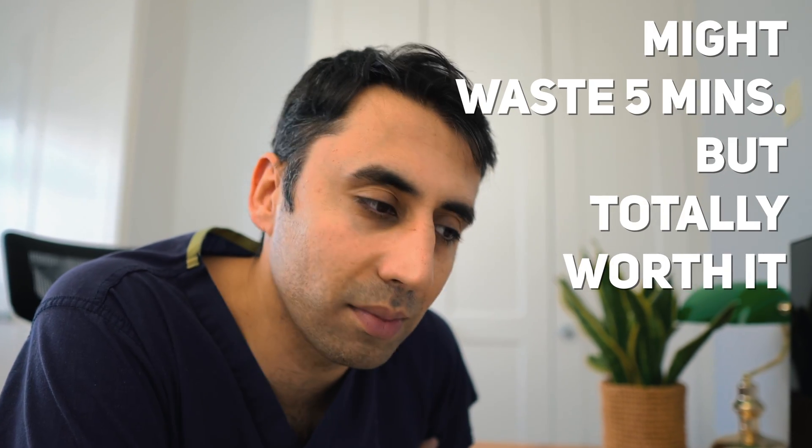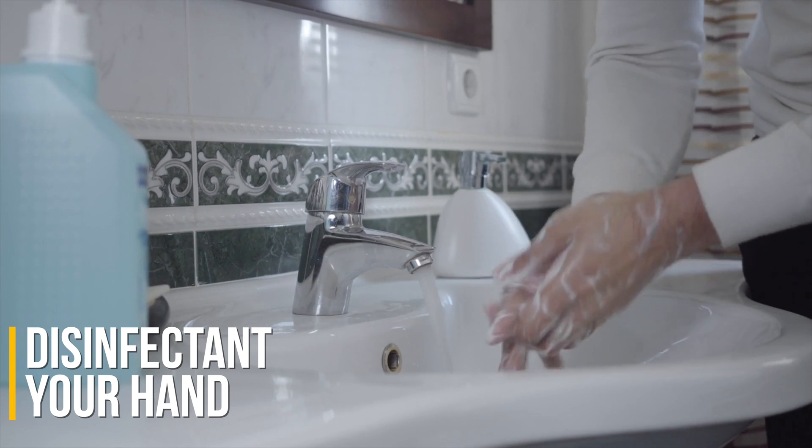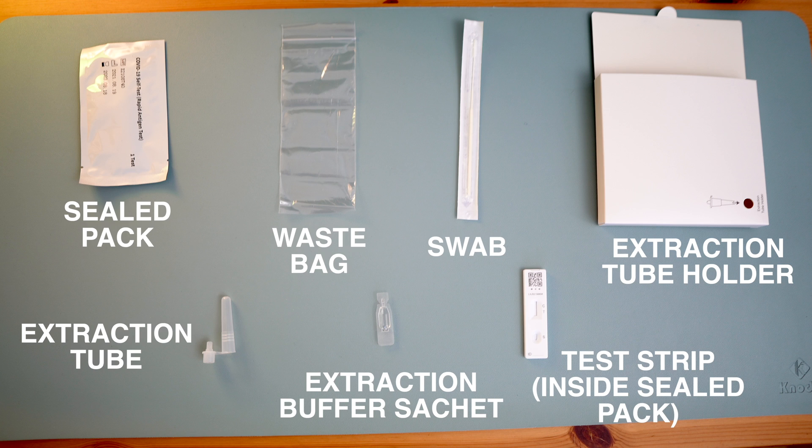Have a little read. After you've done that, disinfect your hands by washing with warm water and soap for 20 seconds, then get all the equipment out from your test kit box — it should all look like this — and make sure you've got each aspect of the equipment.